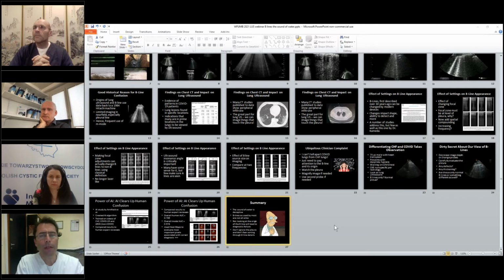So just to follow up on this issue, you said that this could be useful to monitor the situation over hours or days. How do you quantify? Because to say something has changed, you have to say this is worse. And if you are the only one performing ultrasound, you can have in your mind, in your memory, the situation of the day before. Otherwise, do you have any numerical score that you utilize in your unit to say that this is worsened? How can you assess that the situation is stable rather than changed, in case that there is not only one single physician performing ultrasound?